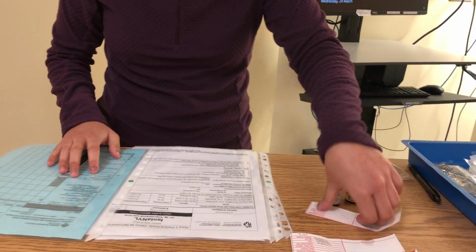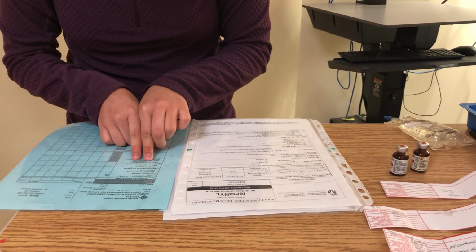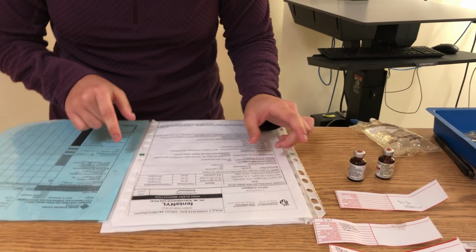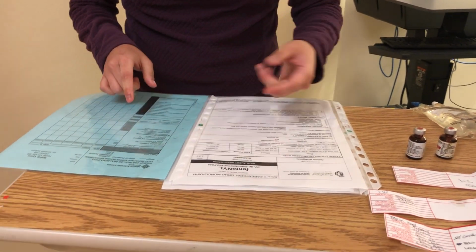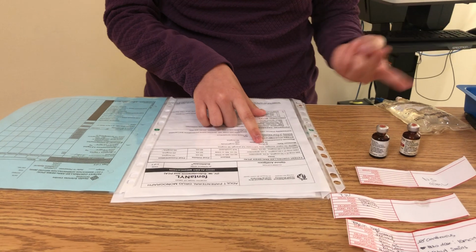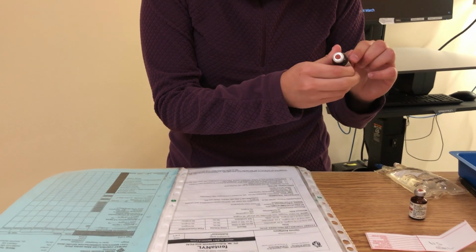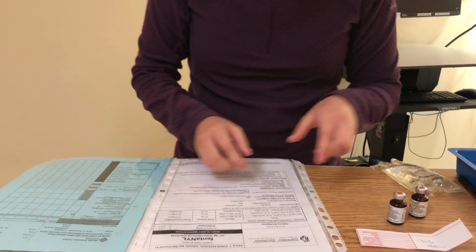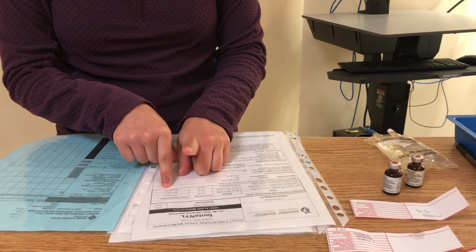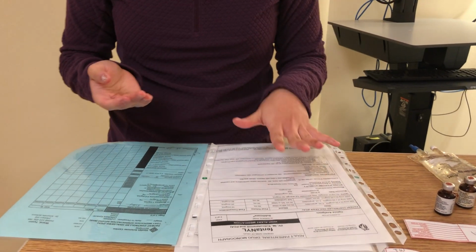So first check here, we have patient Tyson Ward. We have here doctor ordered fentanyl. This is my PDM's fentanyl. So the dose is 10 micrograms. So in order to get that, as per my recipe, I need 500 micrograms, which needs 2 vials that have 50 micrograms per ml. So this is fentanyl, 50 micrograms per ml, and I know it's not expired. And I have a diluent of 40 ml to get a final volume of 50 ml and final concentration of 10 micrograms per ml. The route is via PCA Graesby, and then the date and time is today, now.